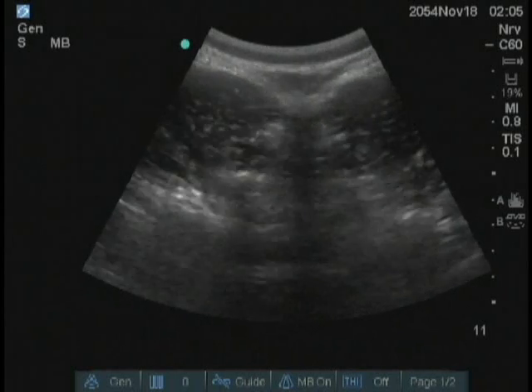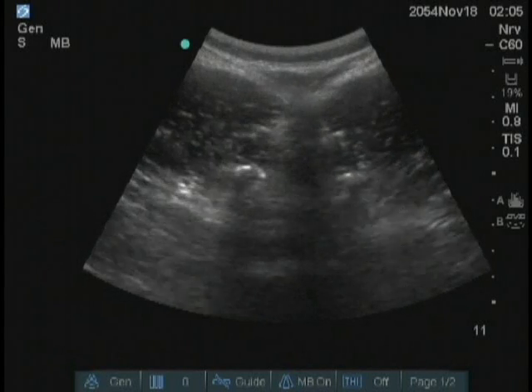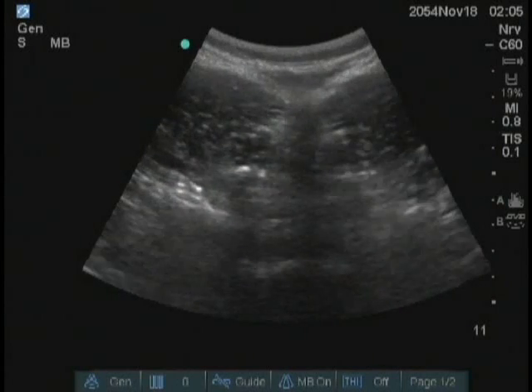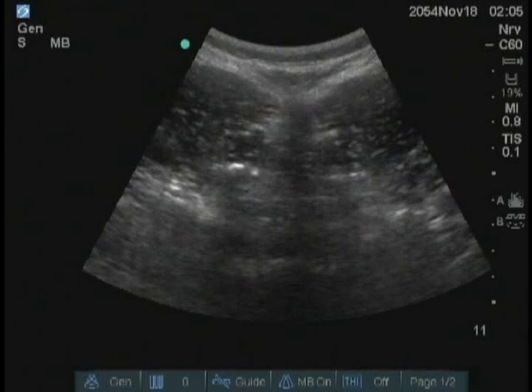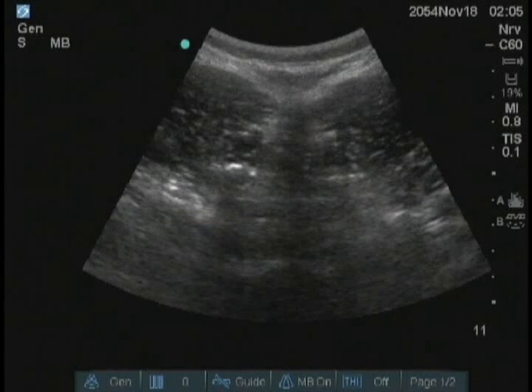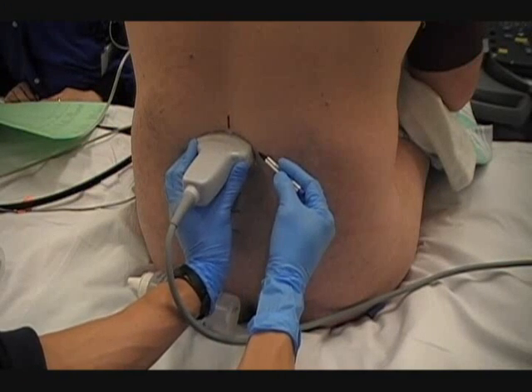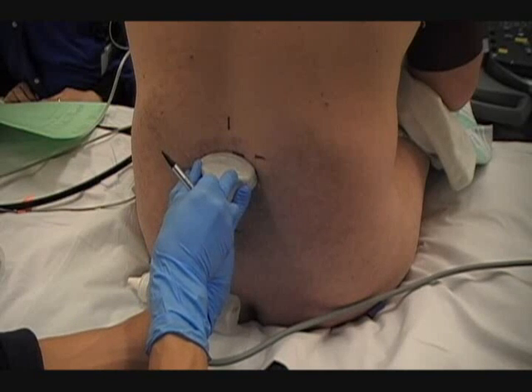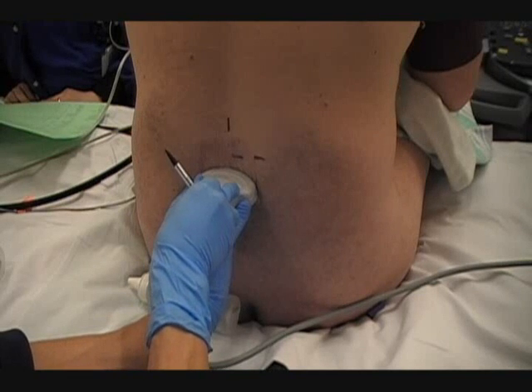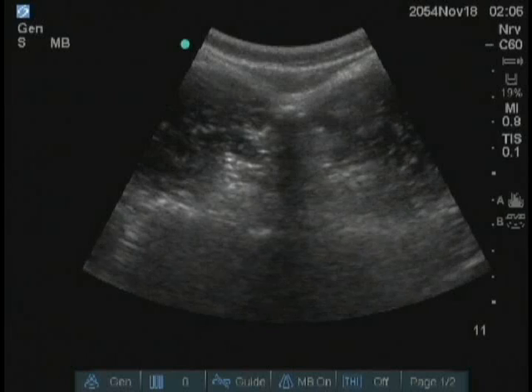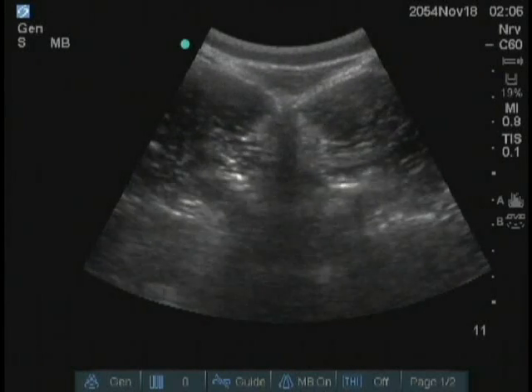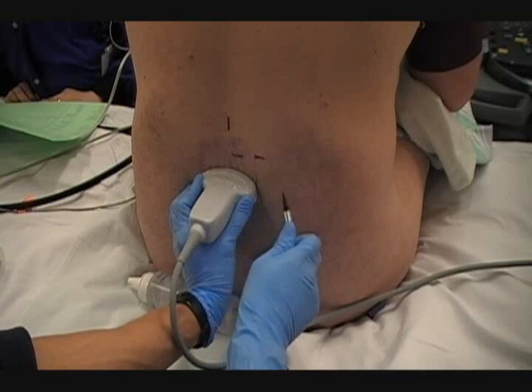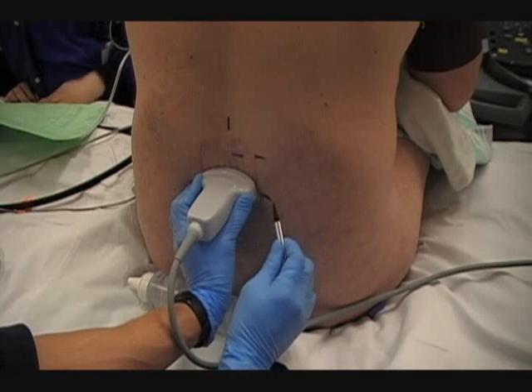The anterior and posterior complexes, which delineate the boundaries of the vertebral canal, appear out of the acoustic shadow as linear hyperechoic structures. The articular processes and transverse processes are usually also visible in this view. Once the optimal interspinous view has been obtained, the midline is centered on the screen. The location of the neuraxial midline and the interlaminar space may now be marked on the skin, where they correspond to the midpoint of the long and short sides of the probe respectively.